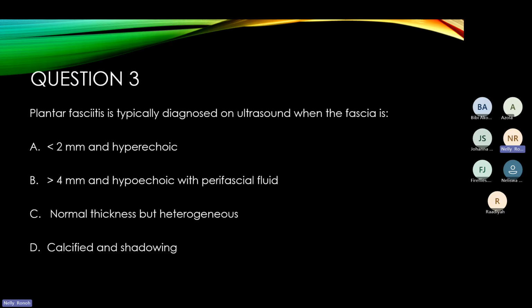So I can see we have 5 minutes left. Let's do it quick. So plantar fasciitis is typically diagnosed in ultrasound when the fascia is... someone to try? B. I think it's B, more than 4 millimeters and hypoechoic with perifascial fluid.